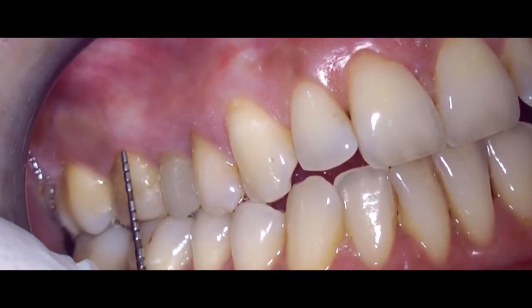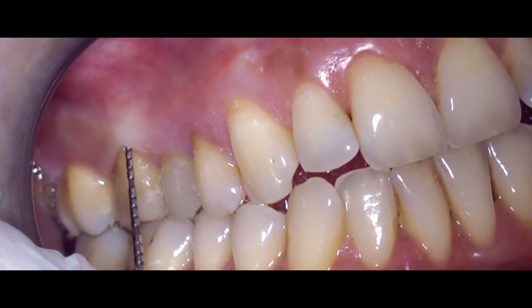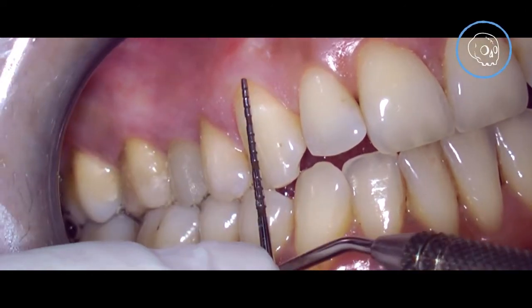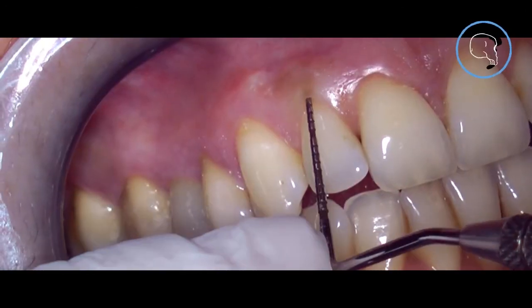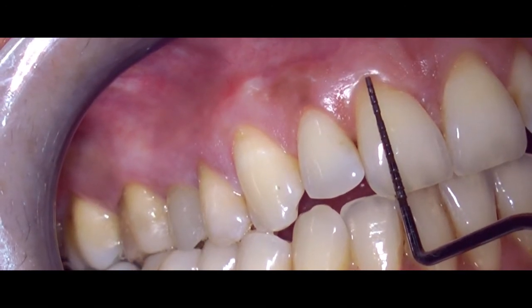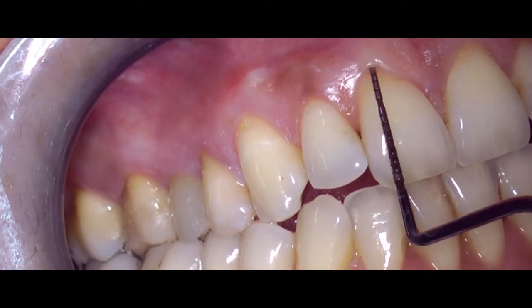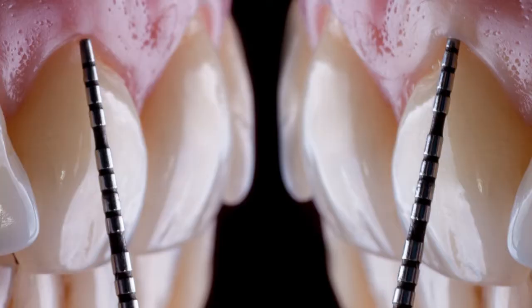In the case that I will show you next, we use two lateral approaches in order to achieve root coverage from tooth 16 to 26. We actually started on the patient's right side and then decided to carry on to the left side when we reached completion of the first quadrant.